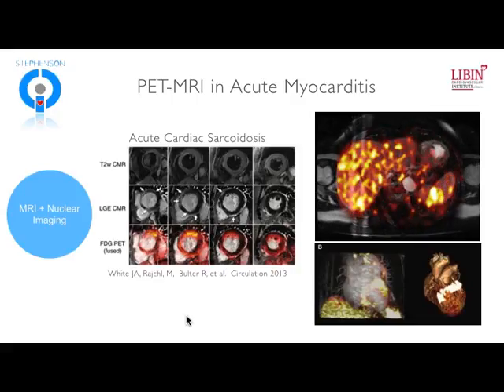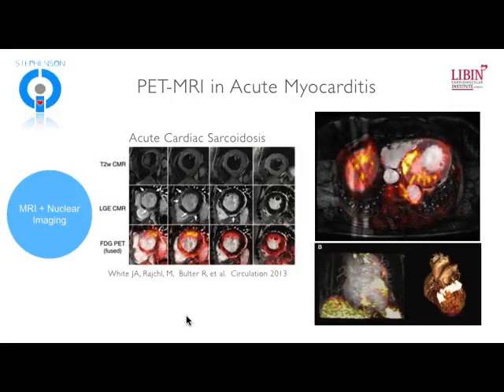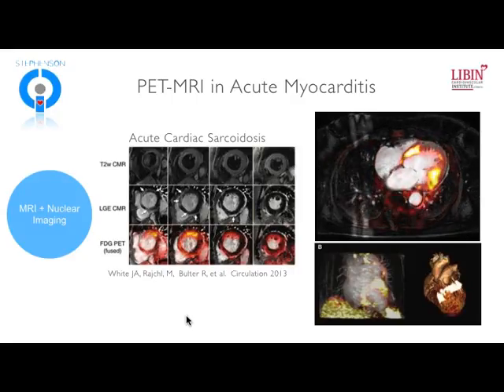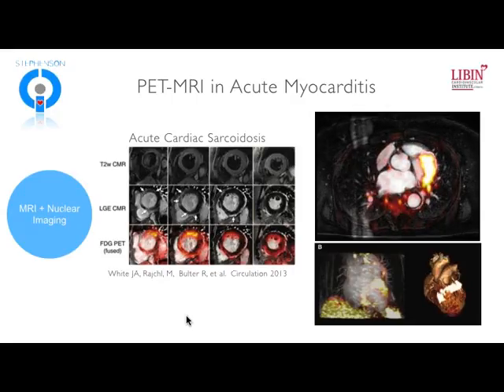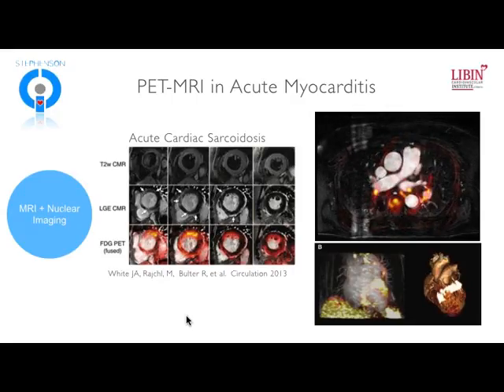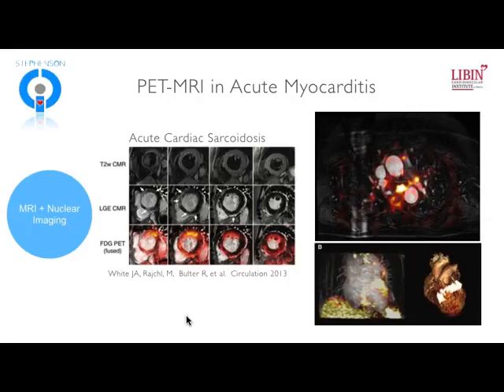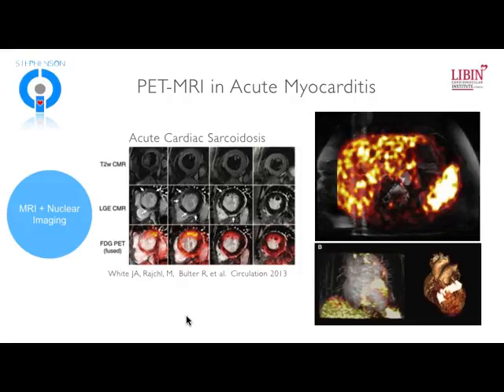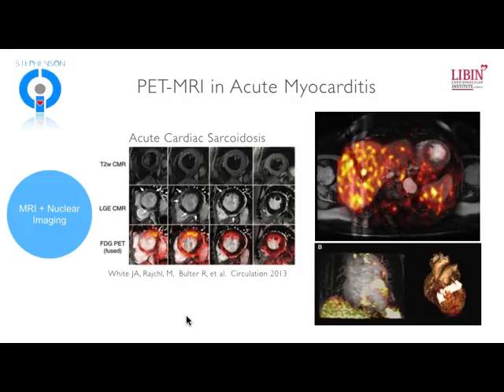So normally the myocardium has some basal glucose metabolism, and that shifts based on whether or not we've been eating recently or we've been in a fasting state. But often, especially if we're eating regularly, we'll have a basal glucose metabolism that's reasonable to have significant uptake of a glucose-based tracer, which is fluorodeoxyglucose. And this indeed has been used for looking at viability imaging of the myocardium with PET.